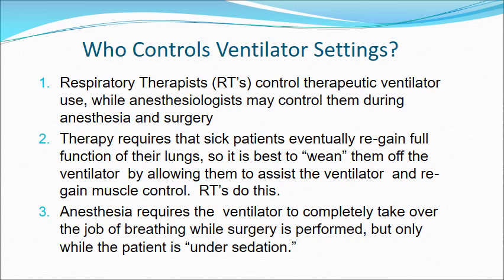RTs do this. Anesthesia requires the ventilator to completely take over the job of breathing while the surgery is performed, but only while the patient is under sedation. And this tends to be a short-term procedure. The ventilator is not responsive in any way to the patient. It simply takes over the entire task. Much of the complexity of ventilators has to do with the respiratory therapy use, where they allow the patient to control their breathing as much as possible.